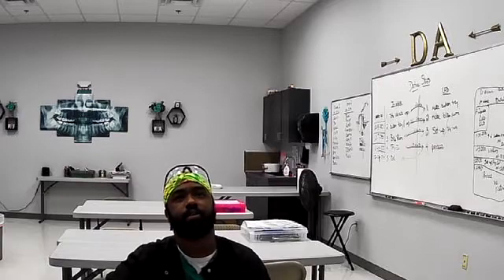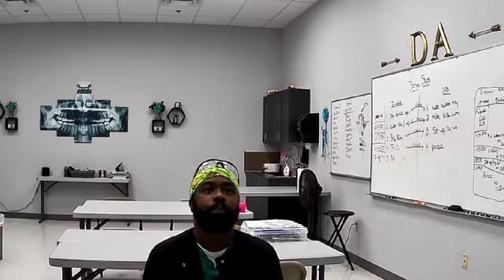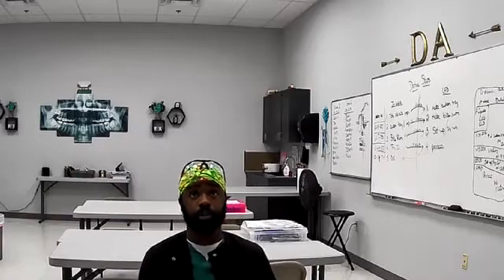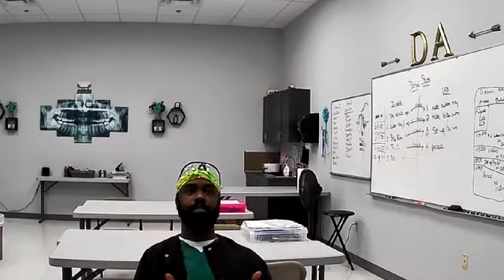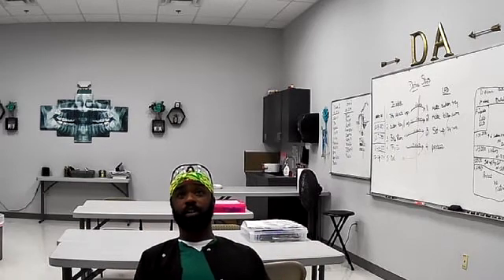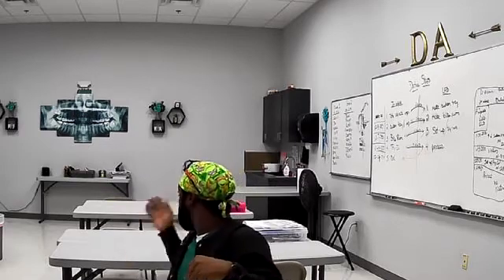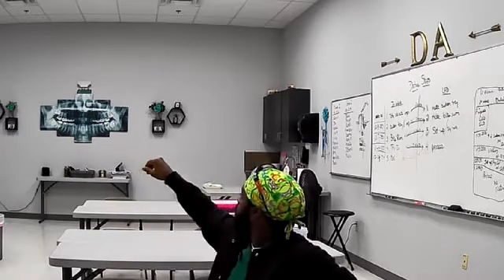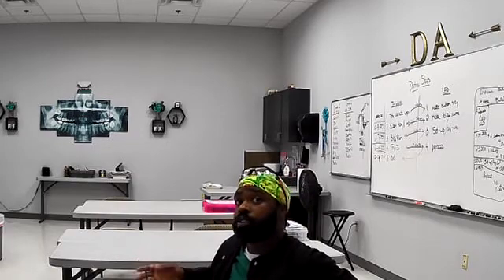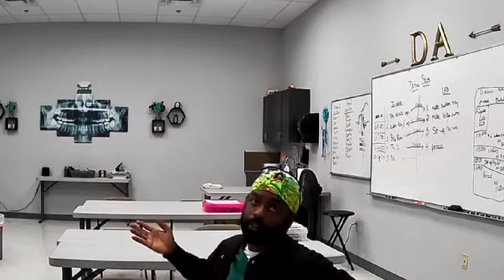The next kind of X-ray is the panoramic, which is the pano back there. Panoramic X-rays, just like panoramic photos, are used to take images of the entire mouth, the entire area. It shows the position of fully emerged, emerging, and impacted teeth all in one image. You can see it: you have 1, 16, 17, and 32 back there. They're not out yet, so they're just buds. They're growing, but you also have the rest of the teeth already developed.